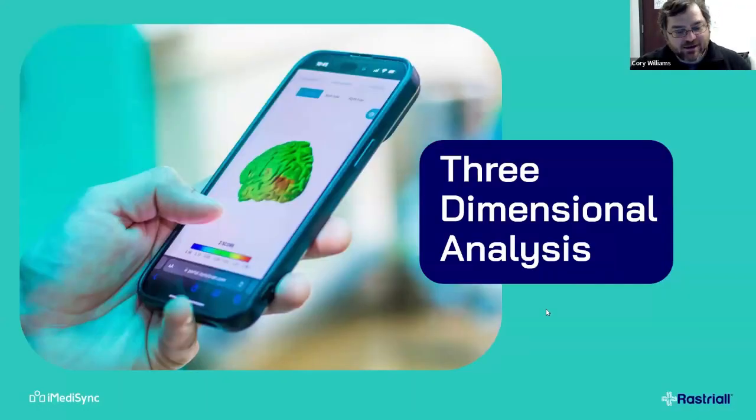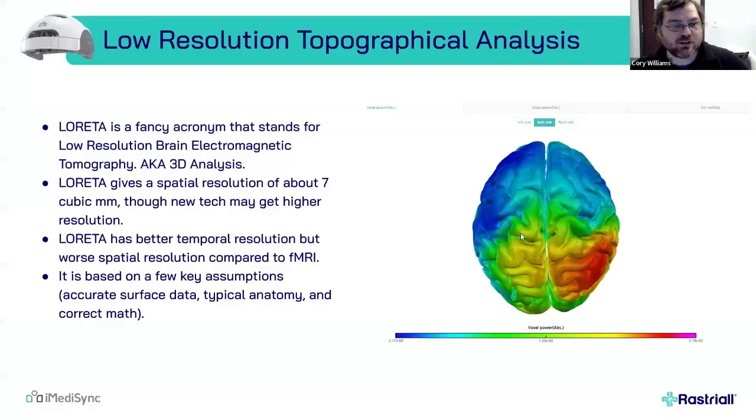Now, obviously, the brain is a three-dimensional thing, so we want to look at it in 3 dimensions, right? And to do that, we use something called low-resolution topographical analysis, or LORETA. It's a fancy acronym, and it gives us spatial resolution of about 7 cubic millimeters. Some technology might be able to get a little bit more advanced than that.